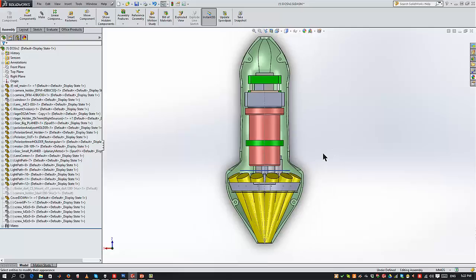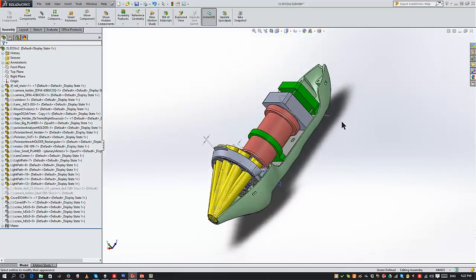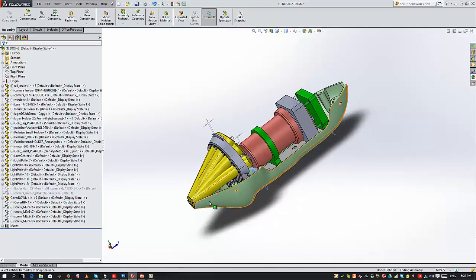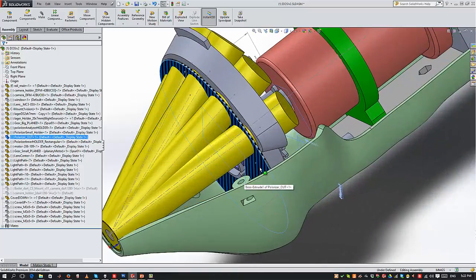Okay, now you see it, and let's see it from the side. The user sticks the lesion over here. Here is the light. Here is the polarizer that's changing. You can see the polarizer here changing.